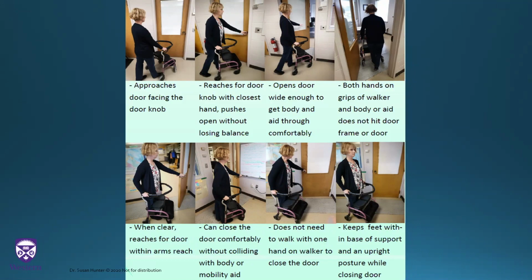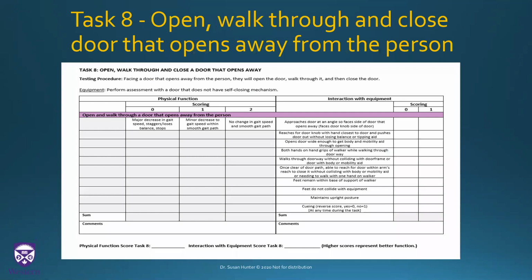And again, they're able to keep their feet within the base of support and an upright posture through this entire task, which is a lot more complicated. And this is essentially the highlights of what I've just gone through, is what you are looking for in the assessment itself.